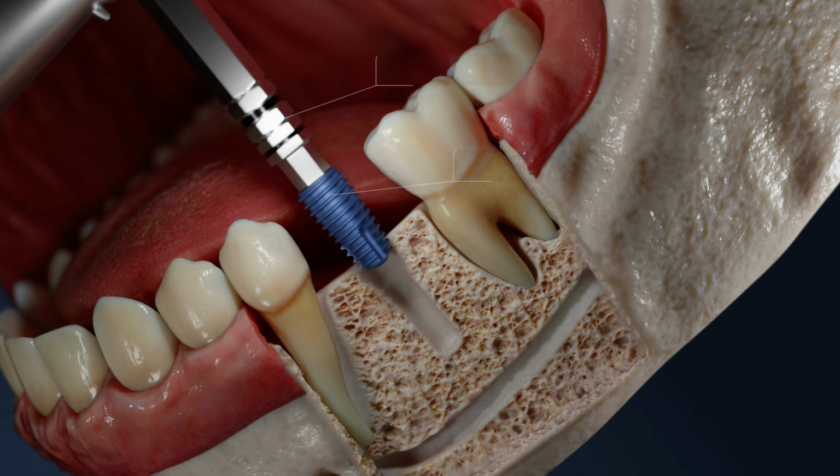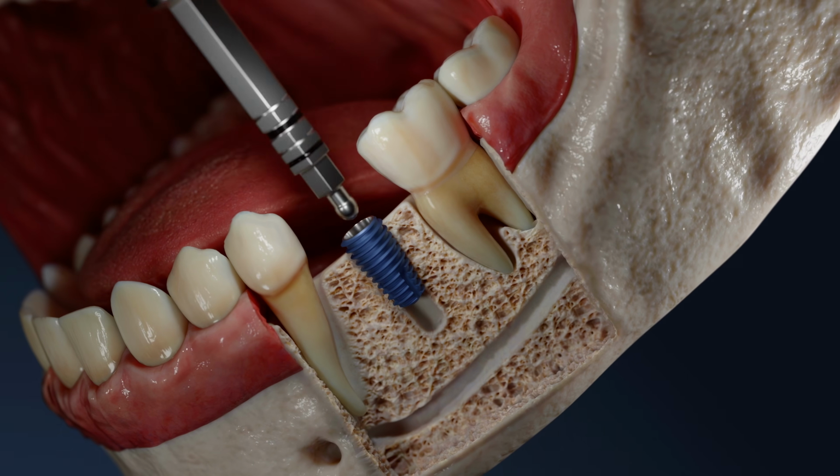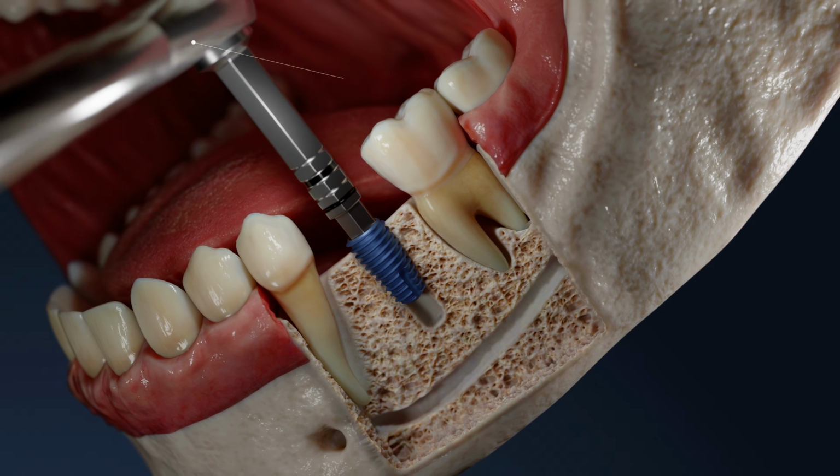The implant is inserted into the implant site at low speed. To seat the implant to the appropriate depth, a torque wrench is used to gradually advance the implant into the jawbone.